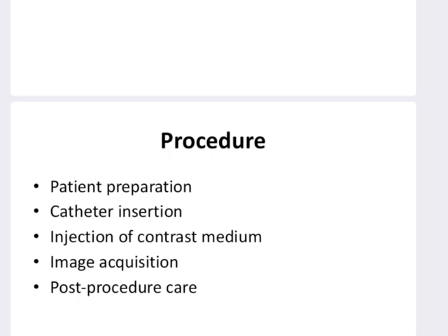The next is the injection of contrast media. After the insertion of the catheter, we have to inject the contrast media, that is, the recommended amount of contrast has to be injected over there. And as the contrast passes through the vessels of the patient's body, the images will be taken rapidly so that we can find whether there was a blockage over the pathway where this contrast media travels. Then these accurate images will be found over the monitor screen, and that can be used by the radiologist and also the angiographers or the cardiologist to view the part where they were doing the angiography procedure.